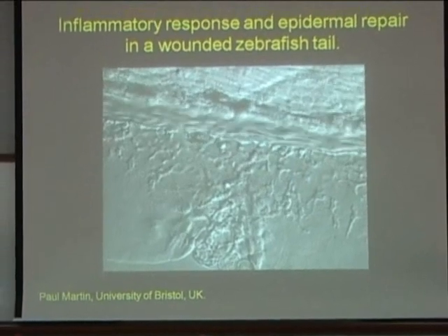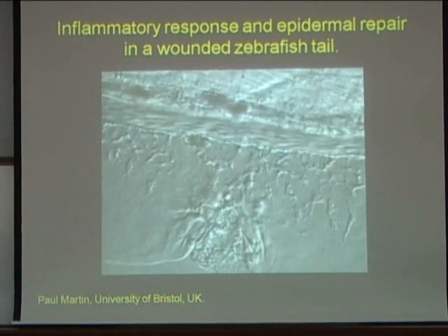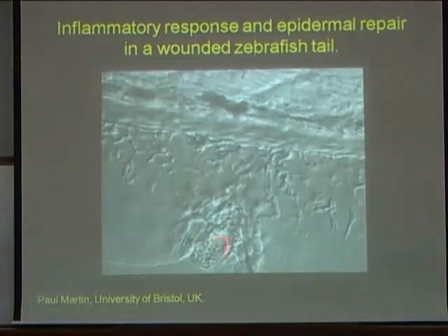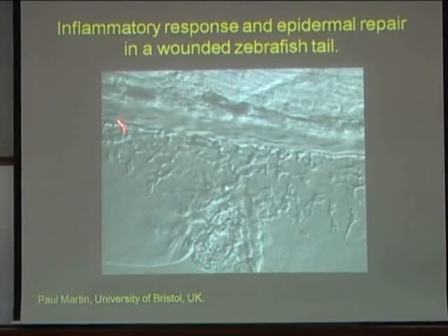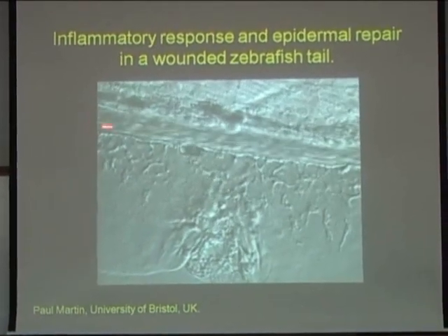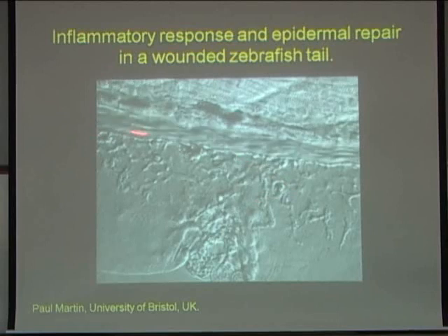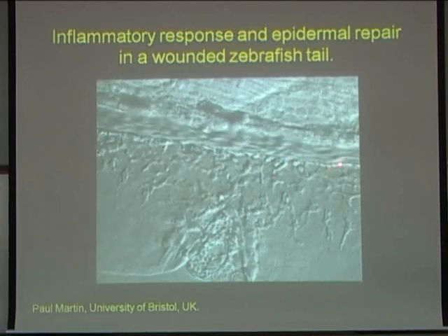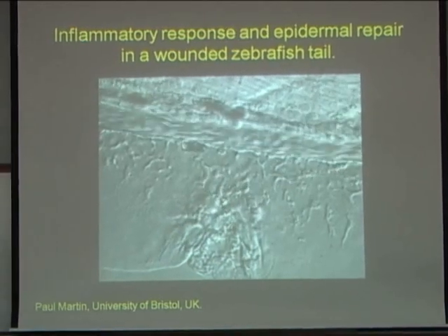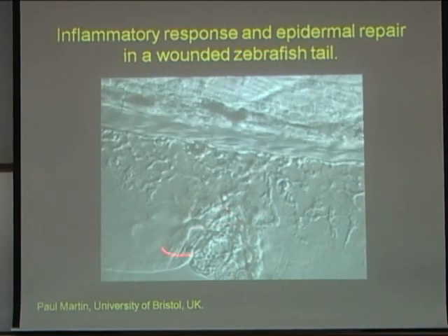the immune response in the tail fin of a zebrafish. So this is the tail fin of a live zebrafish. This is the main vein running down the center of the fin, and this has been stabbed with a tungsten needle. The cytokines are released from this area and are sensed by white blood cells in the bloodstream that adhere to the vessel wall and transmigrate through the endothelial vessel and make a beeline right for this wound, where they clean up debris and hunt down the invading pathogens. So you can see them getting through the blood vessel wall and heading right for this wound area.